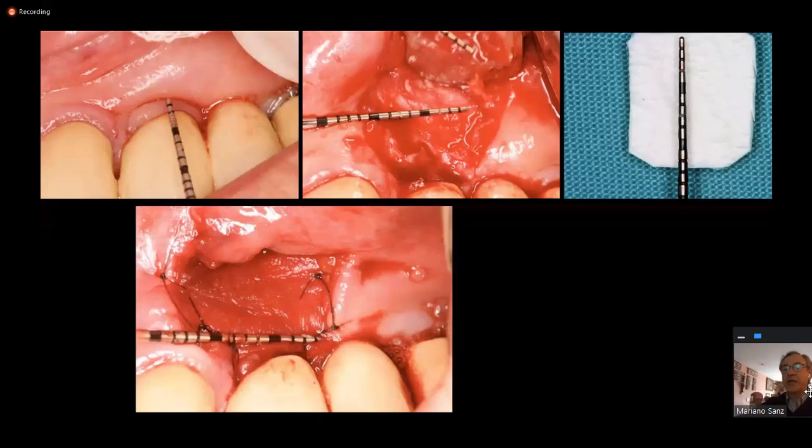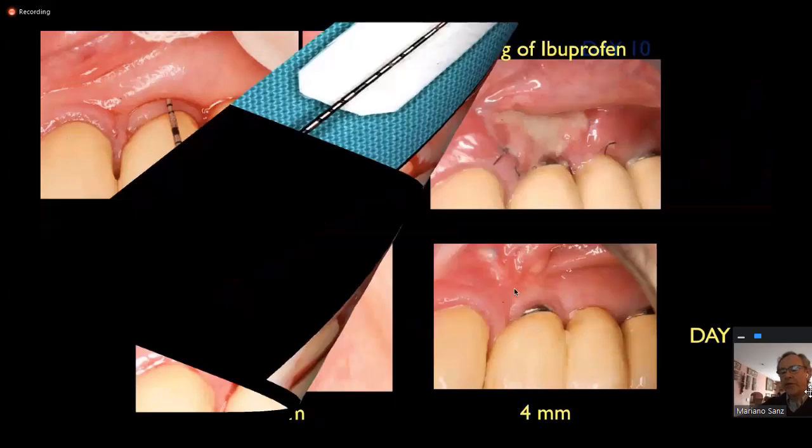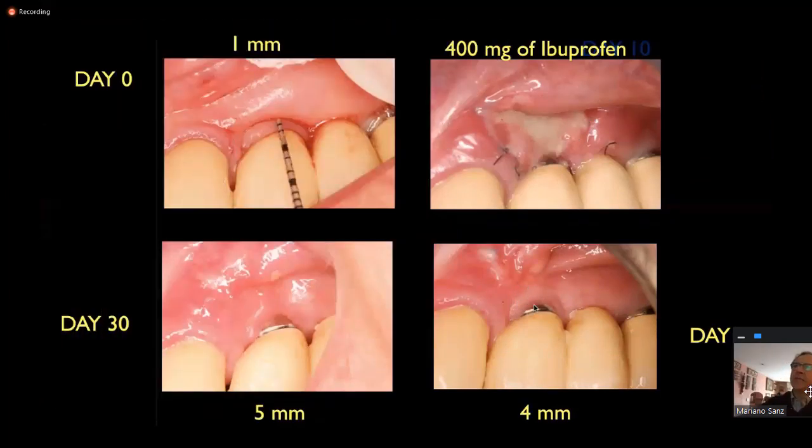If that tissue that comes from the vicinity, mostly from the lateral parts, is a tissue that will keratinize, it will develop keratinized mucosa, and therefore it is highly predictable to gain between 2 to 4 millimeters of new keratinized mucosa by utilizing these matrices.